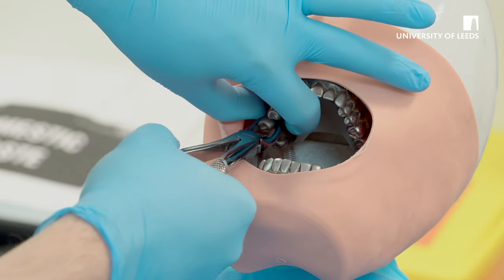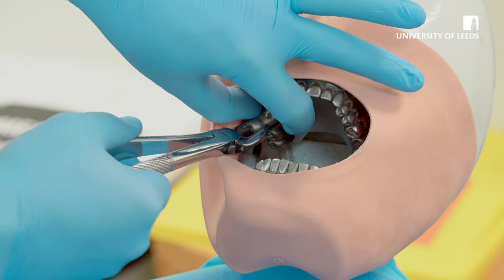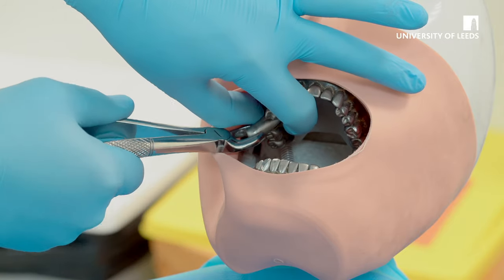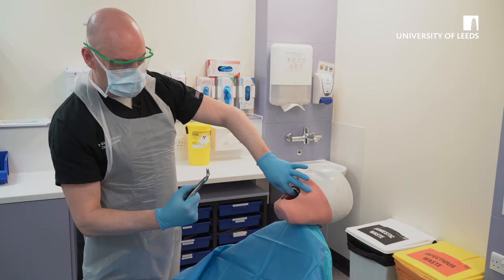Ensure you continue with a buccal motion back to the midline until the tooth starts to mobilise. Once the tooth has been extracted, ensure that you have the apices on the tooth you've extracted, and squeeze the socket.